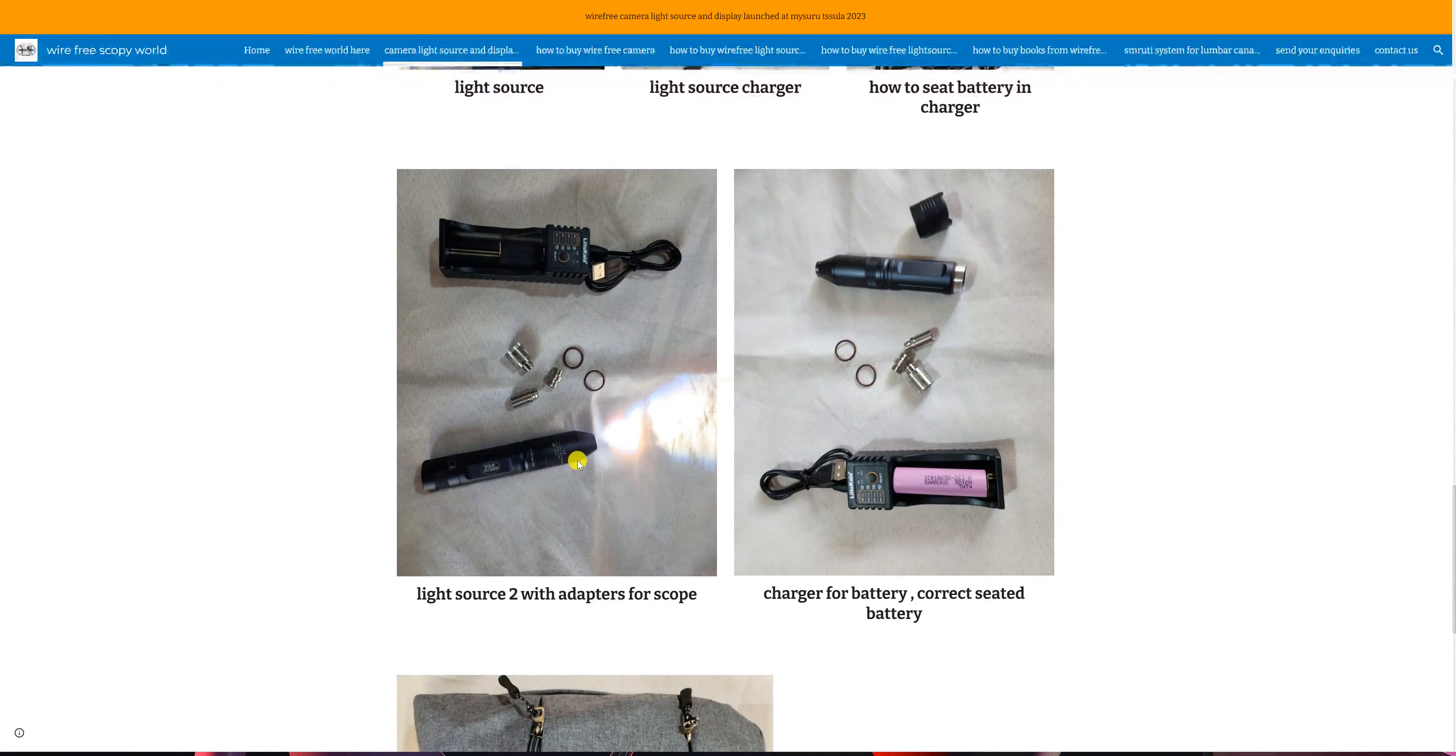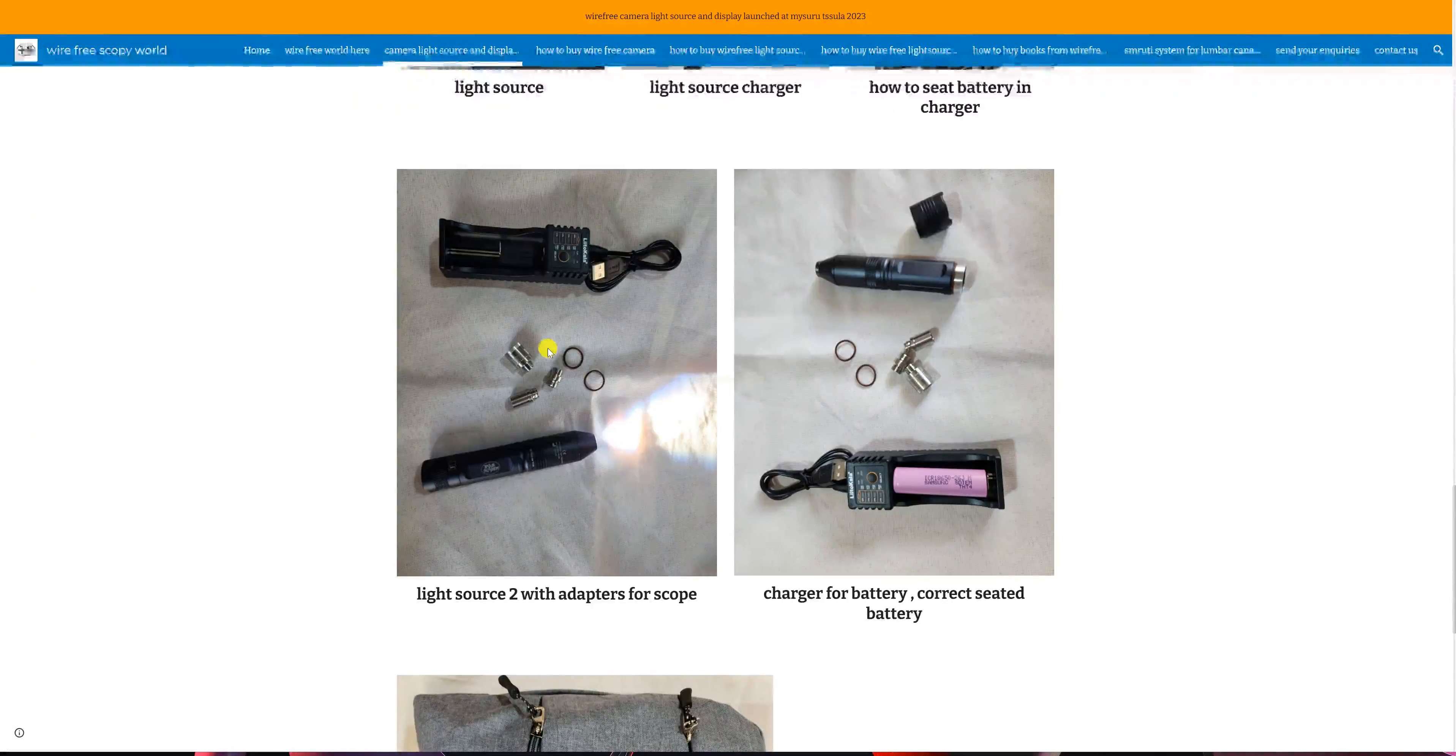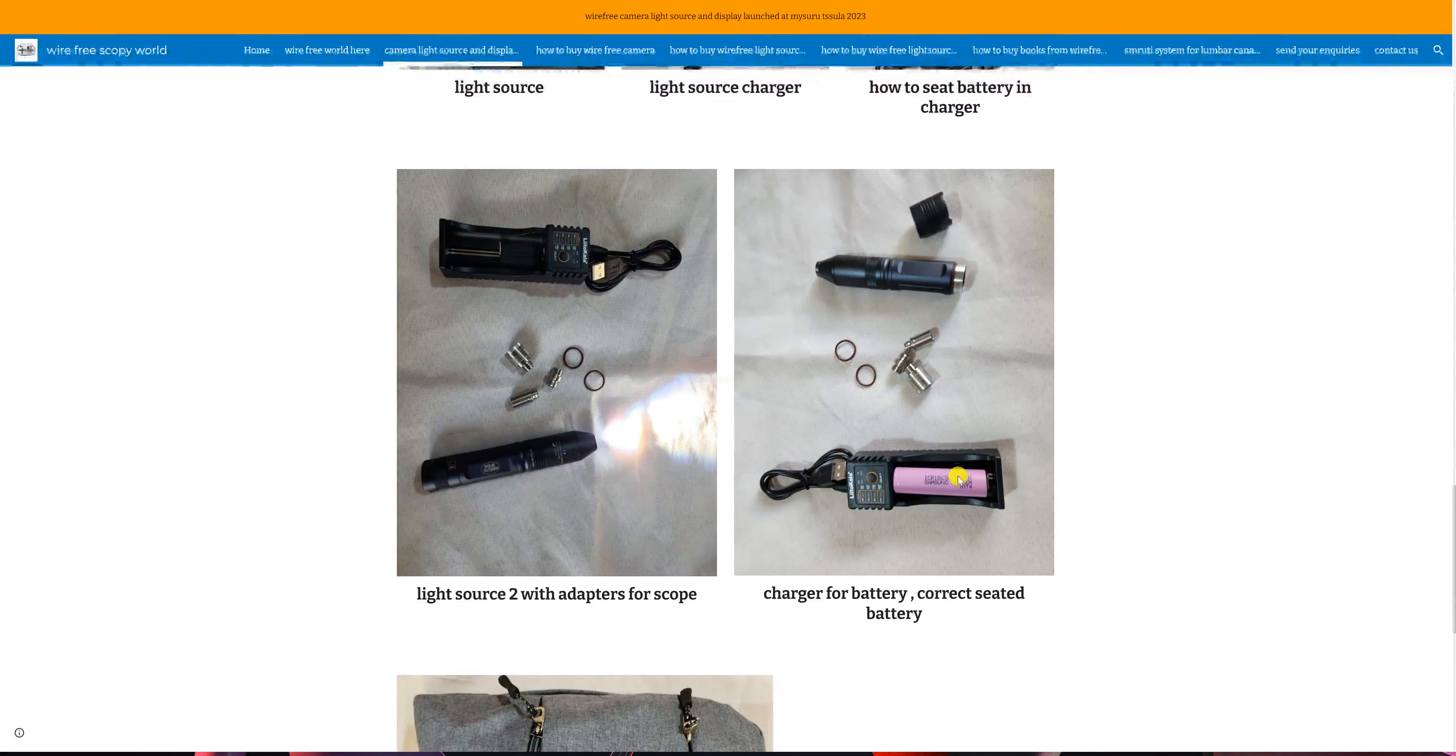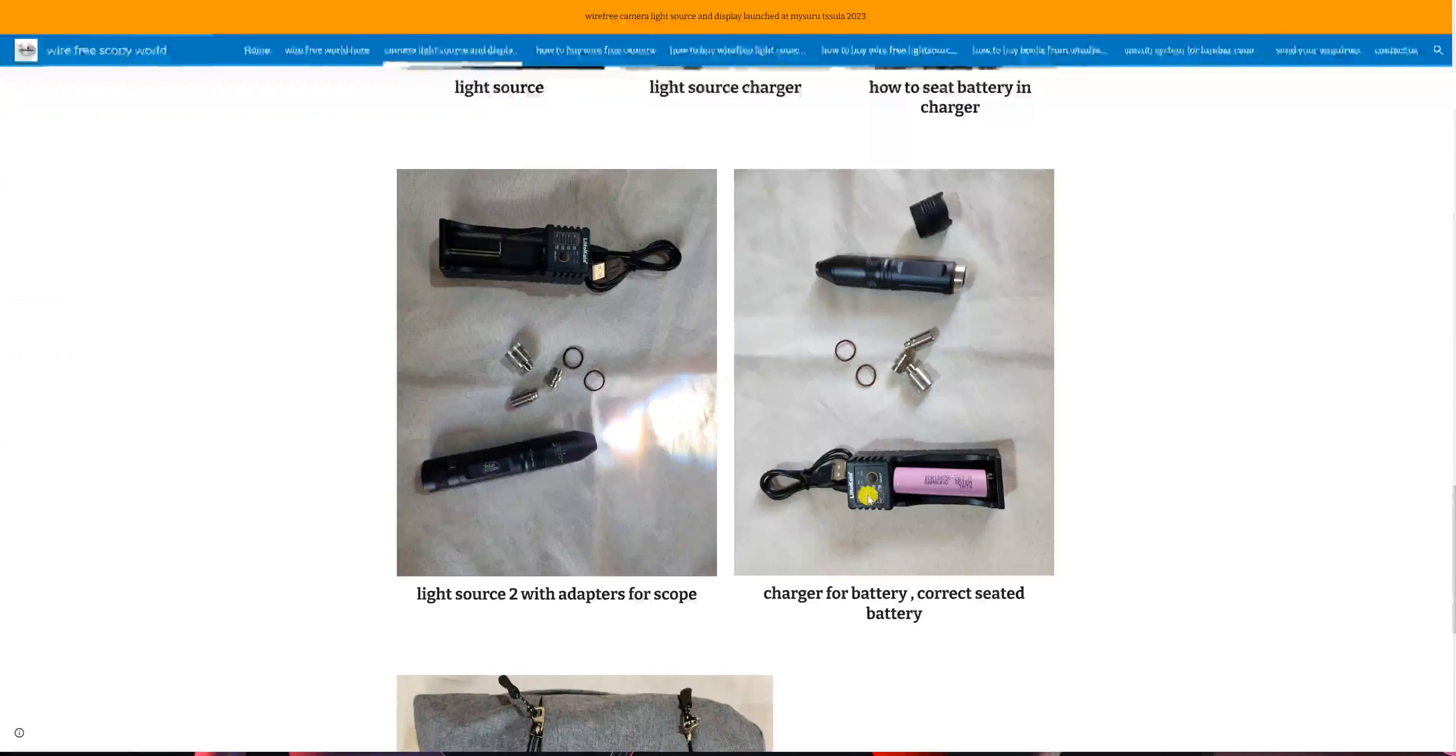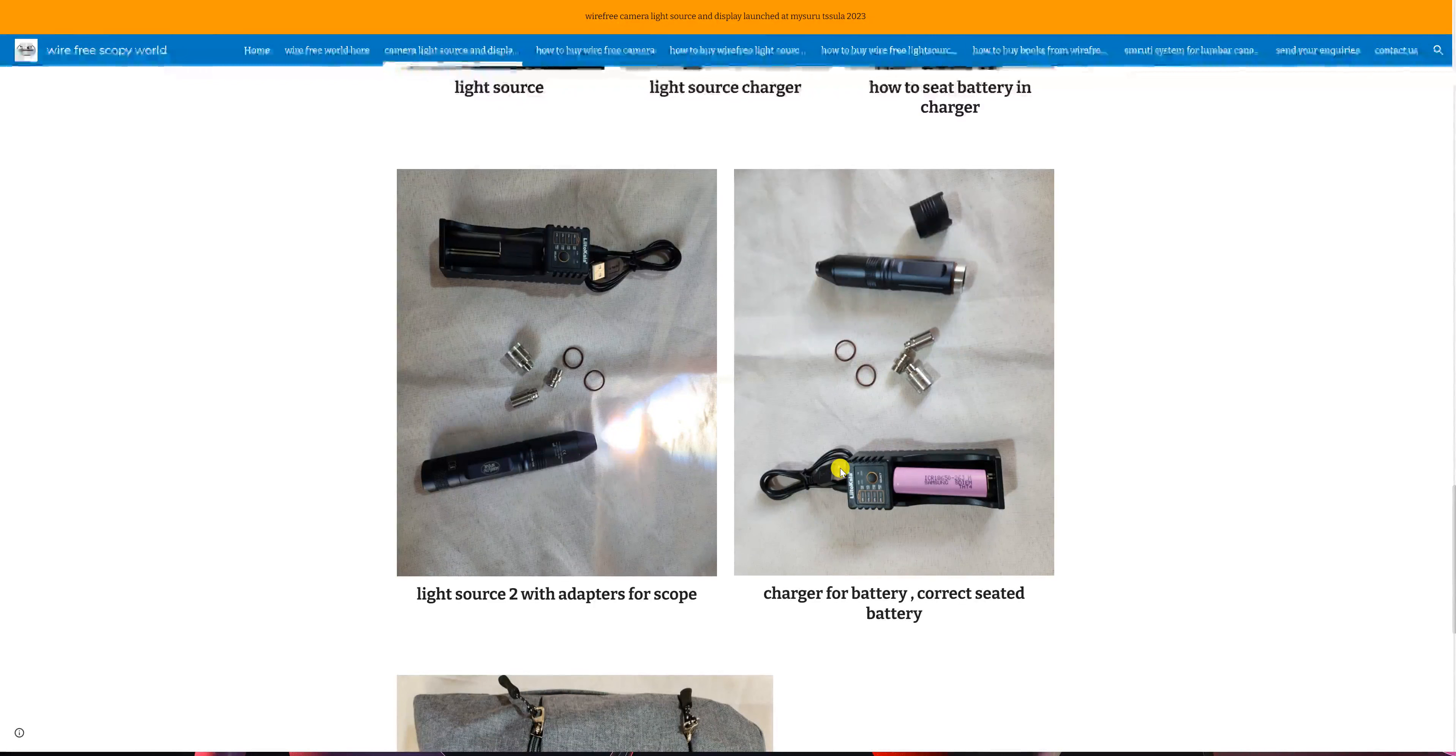The adapters go between the light source and the scope, that is the light port of the scope. This is the charger for the battery, and you can see this is the way we put the battery and it will show how much battery is remaining. This USB port goes in the charging.